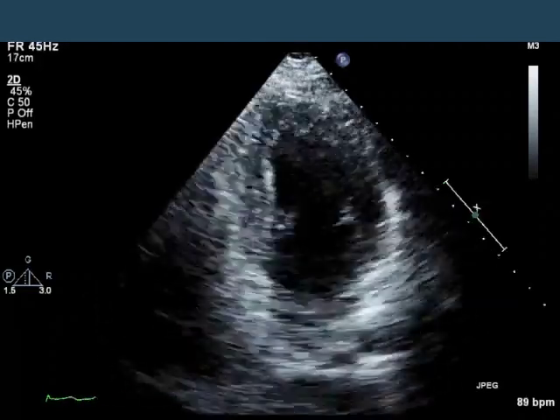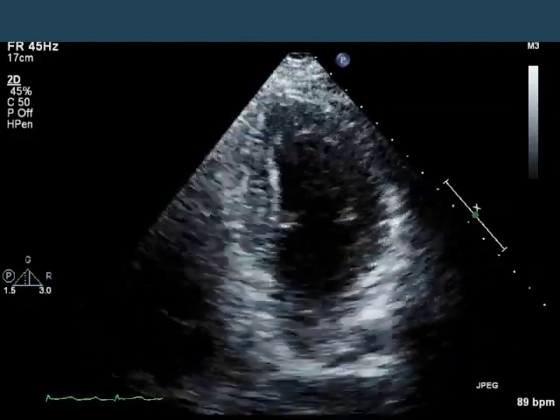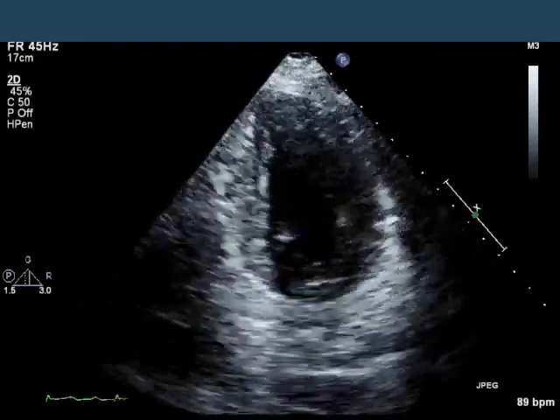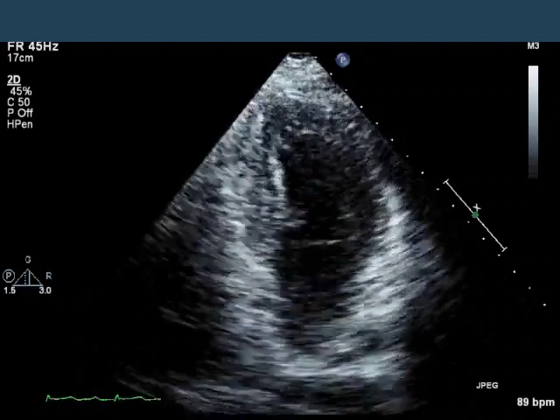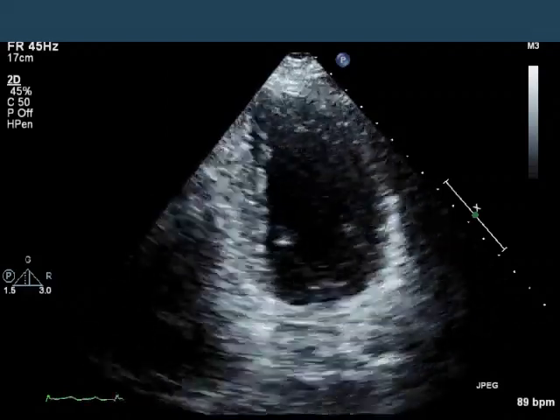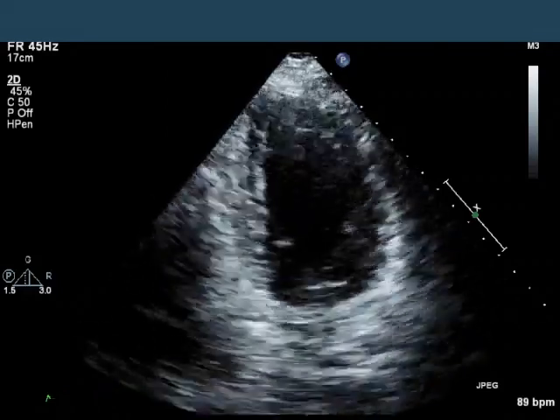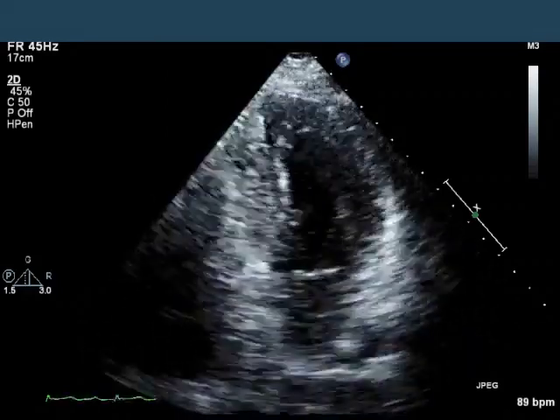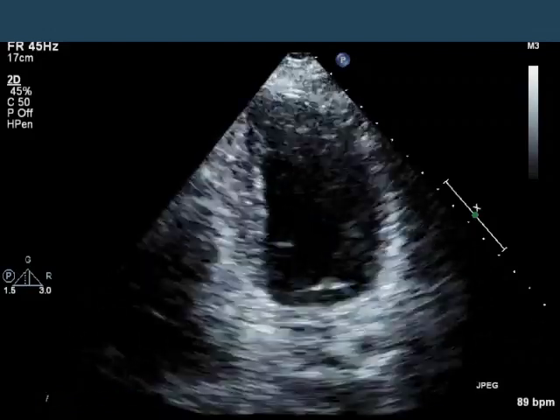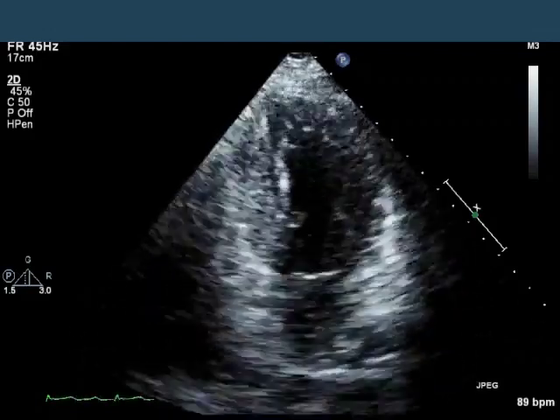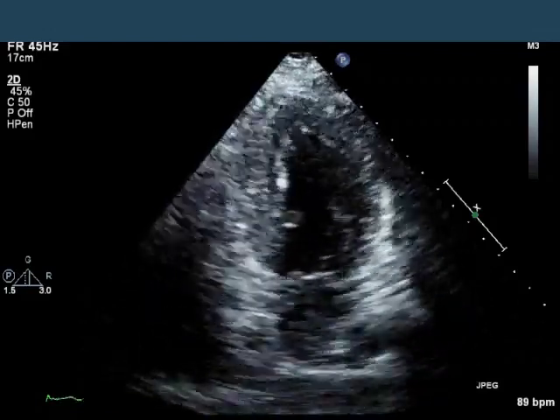In the apical two-chamber view, there's nothing really dramatic here either. The anterior wall looks like it's thickening and the inferior wall looks like it's thickening — both about the same amount. I don't think anyone would call this egregiously abnormal.